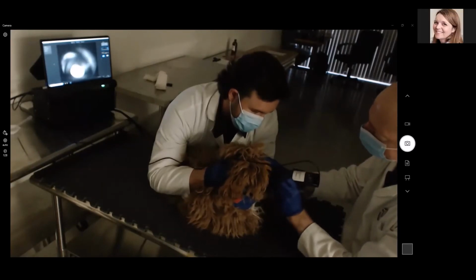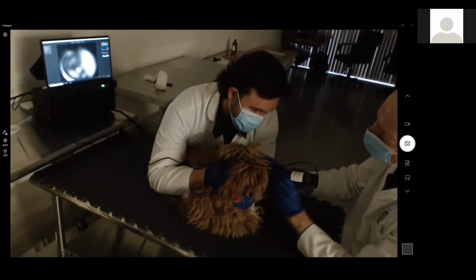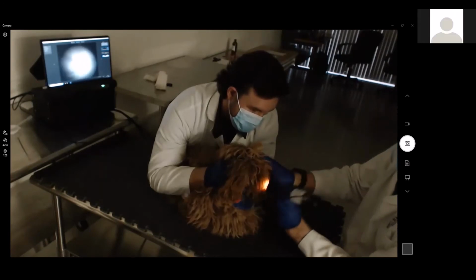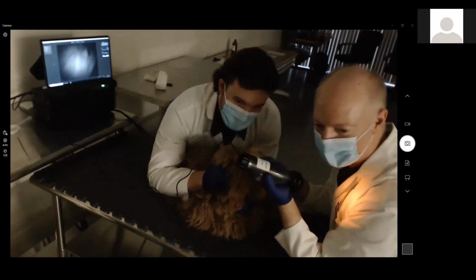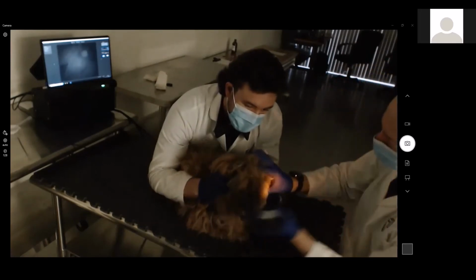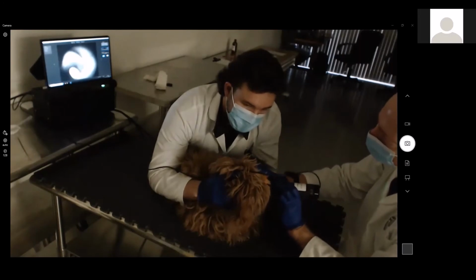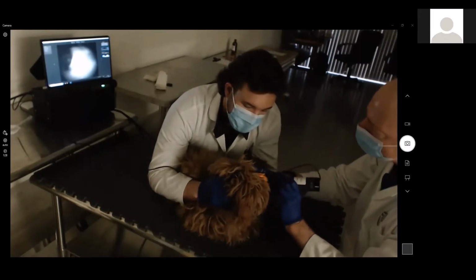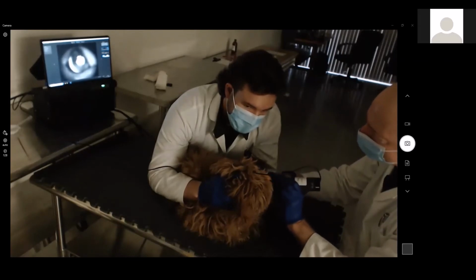Are you able to turn down the light intensity on that? Because it seems like your aiming intensity is making them uncomfortable. I agree. One of the things about this particular design that we're checking out, Jill, is to see how this works in a dilated eye, and whether it's letting in too much light. The controls on the system are fairly limited, so it is a bit difficult. It's kind of upsetting them a little bit with the light intensity.